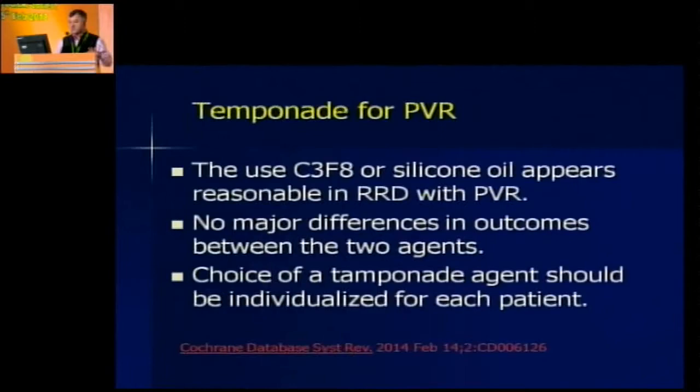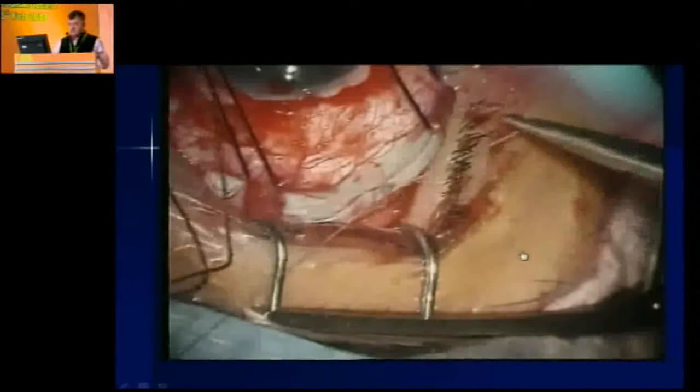Like this here, most of the time in funnel cases, we put a 240 band. And that's very important because they have so much proliferation anteriorly which you are not able to remove.